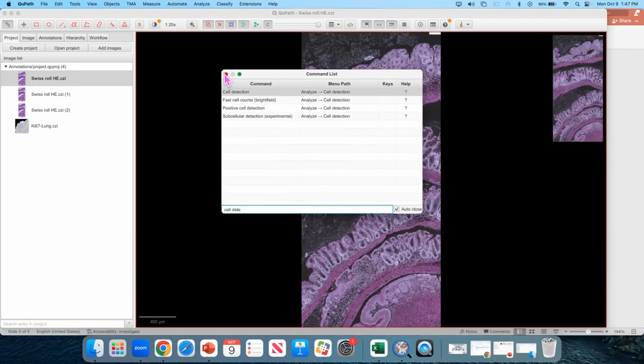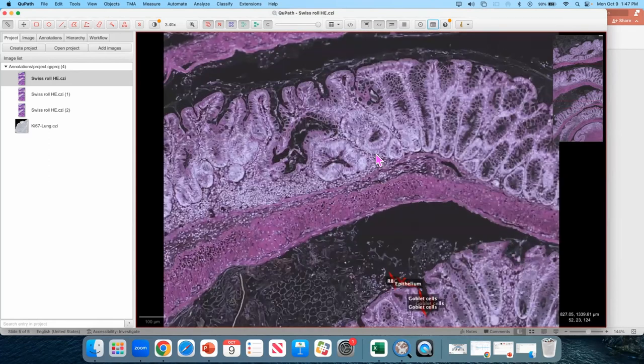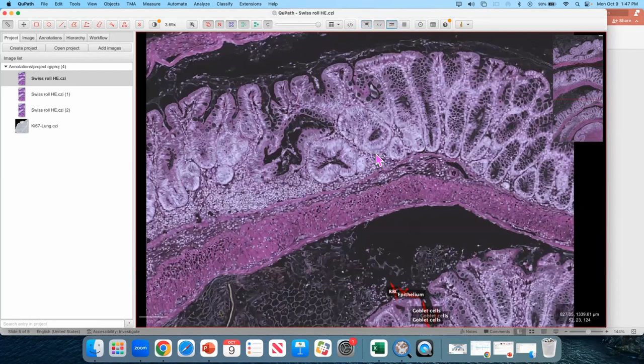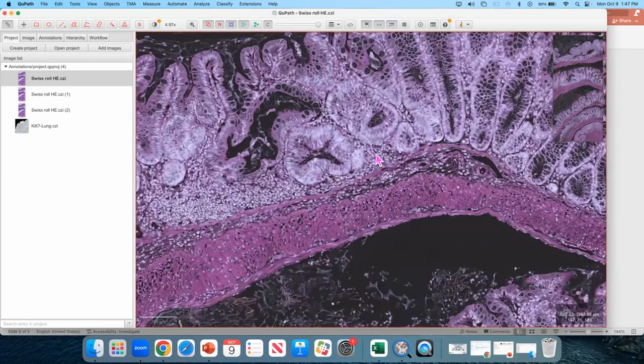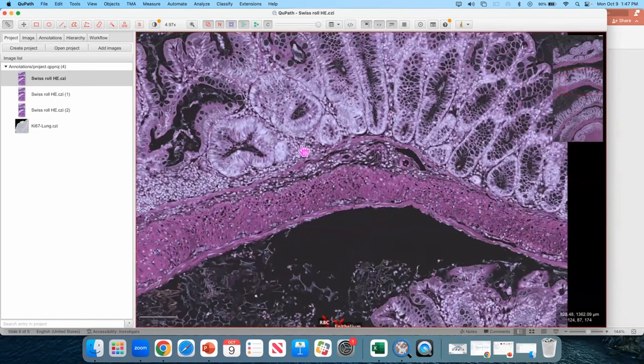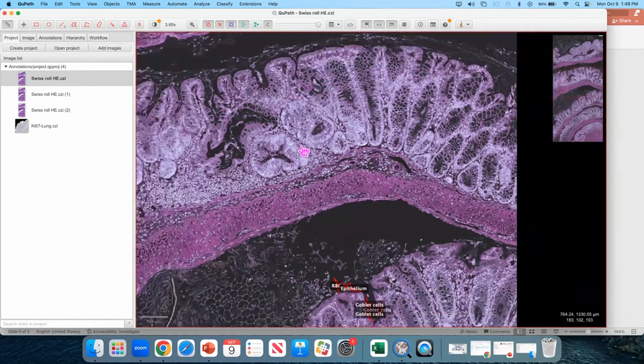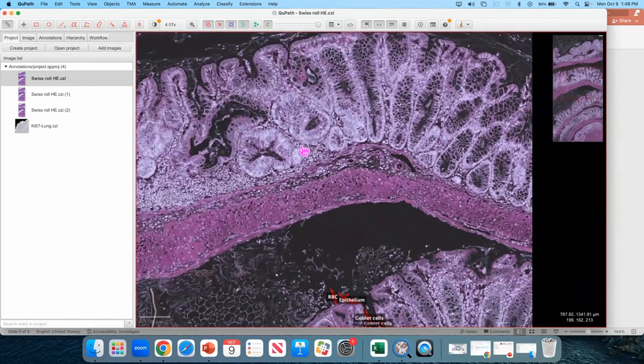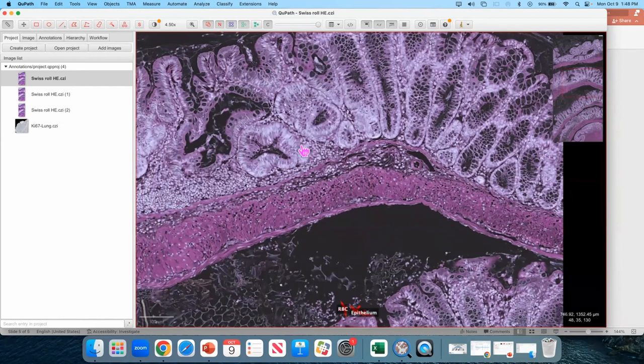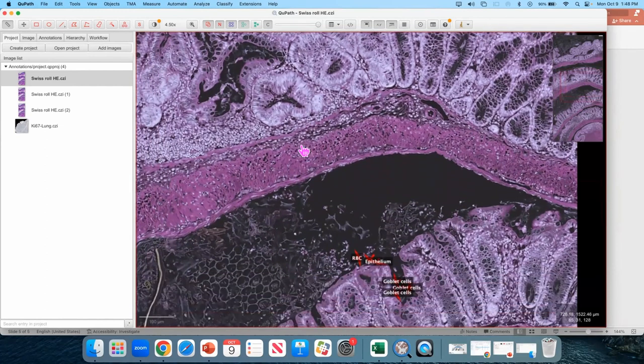Additionally, if you're looking around your slide, if you press shift and the arrow keys - make sure your image is selected. If you're selected on one of the folders at the side or images at the side, your viewing experience might differ with regards to keyboard shortcuts. But you can press shift and then the arrow keys to zoom in and out. Additionally, you can pan over the image just by using the arrow keys on their own. And that is the last of my useful tips.